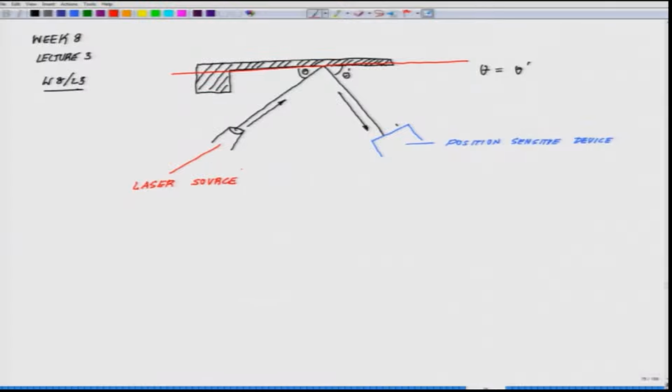Now, on this setup, you grow the cells, assuming that they will form structures like this, which are the myotubes. Now, these myotubes, while they contract, will generate a motion like this.